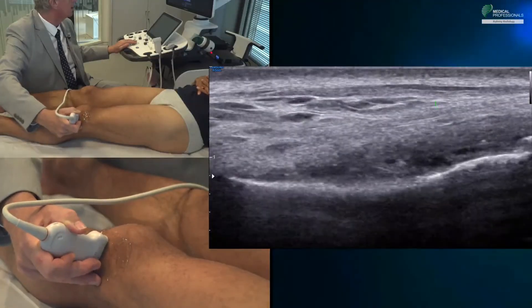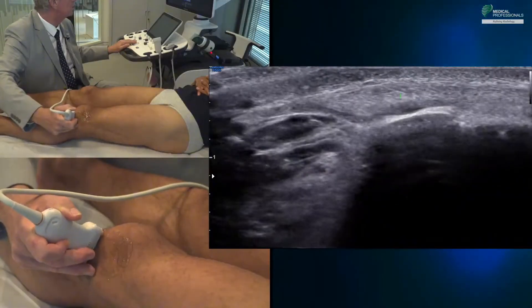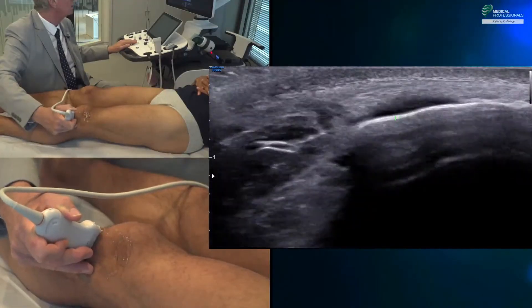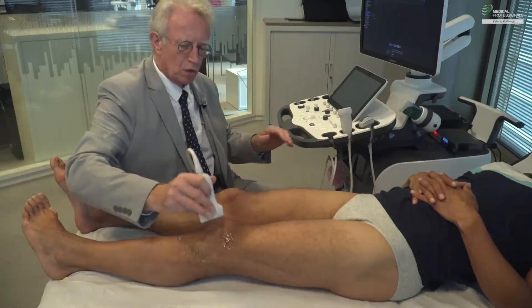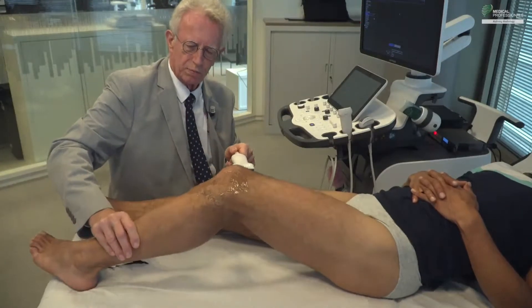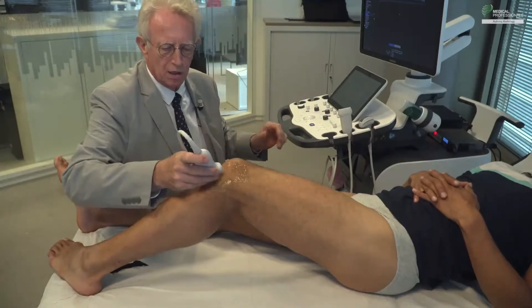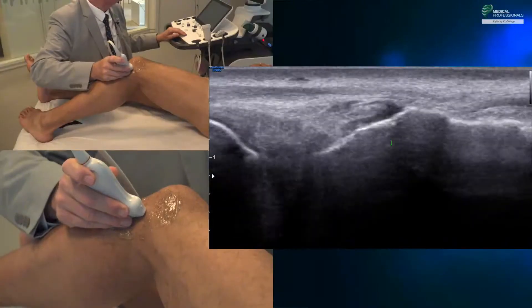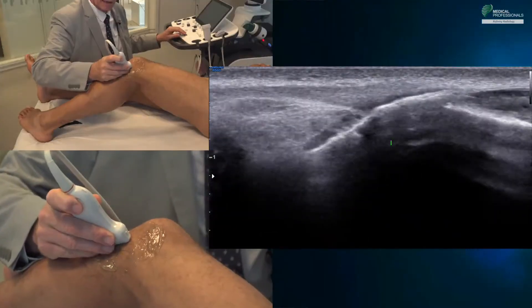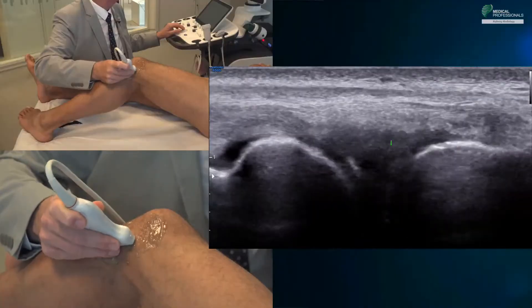We look at this band until its tibial insertion — there it is, no enthesopathy. We have the normal recess on the deep side of this insertion. Once we have visualized this first anterolateral structure, we ask the patient to slightly bend the knee and turn the foot into internal rotation. We then resume the analysis of the iliotibial band and position the probe slightly more posterior.